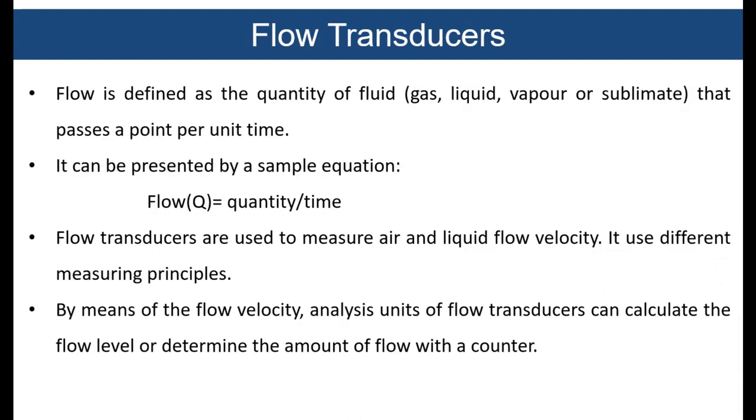Flow transducer. Flow is defined as the quantity of fluid that passes a point per unit time. It can be presented by a simple equation, that is, flow is equal to quantity per unit of time. Flow transducers are used to measure air and liquid flow velocity. It uses different measuring principles.